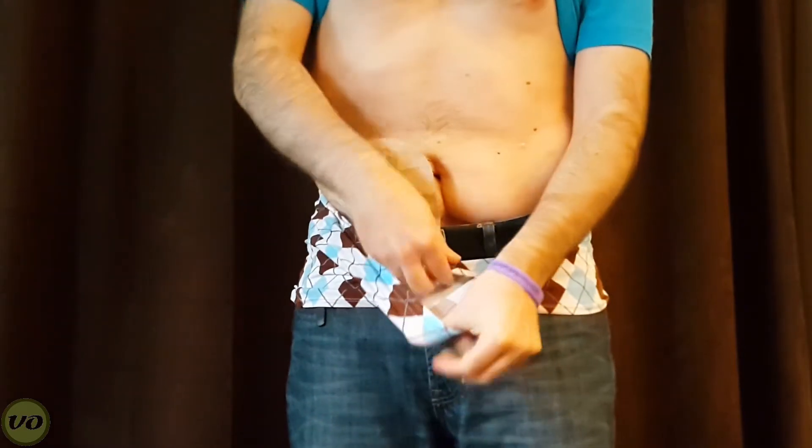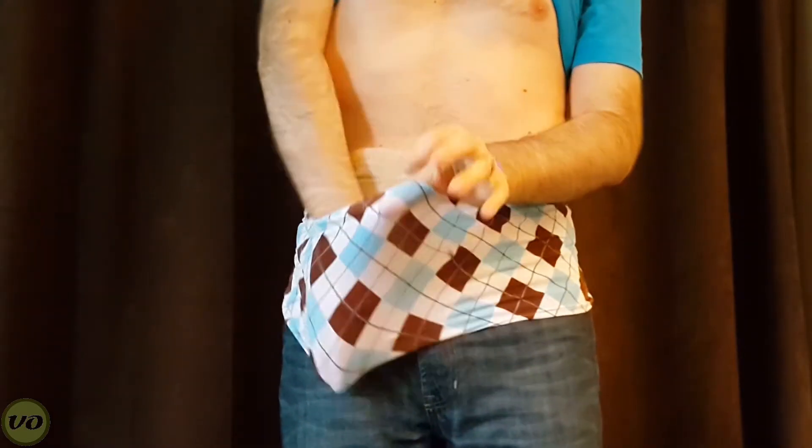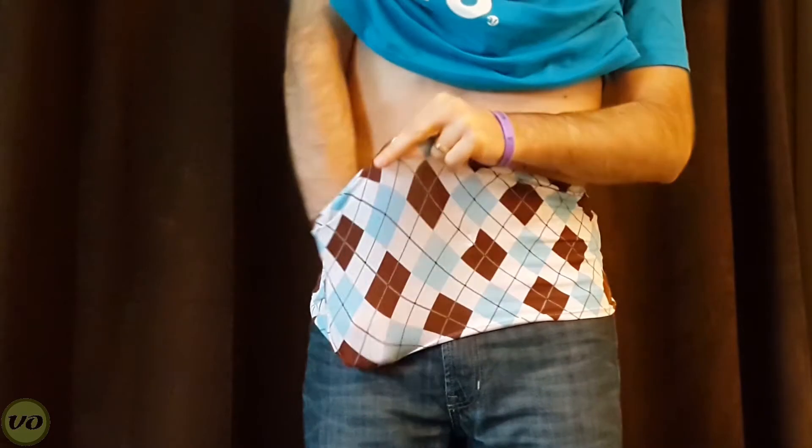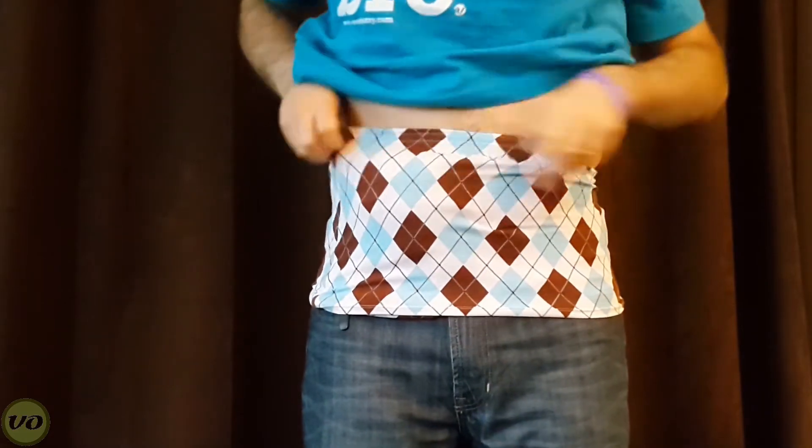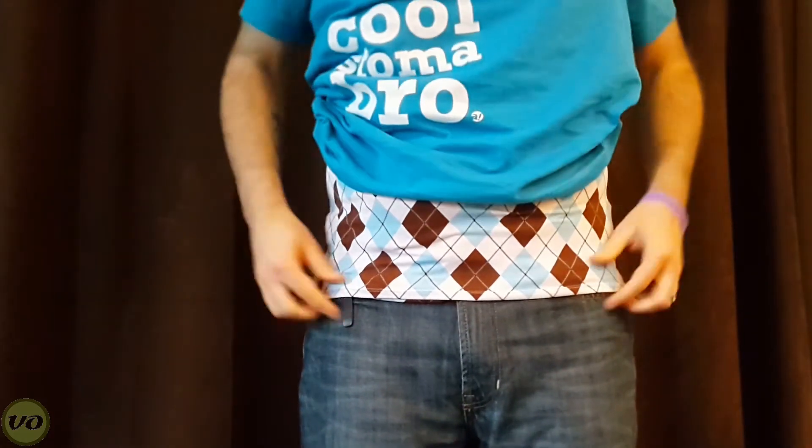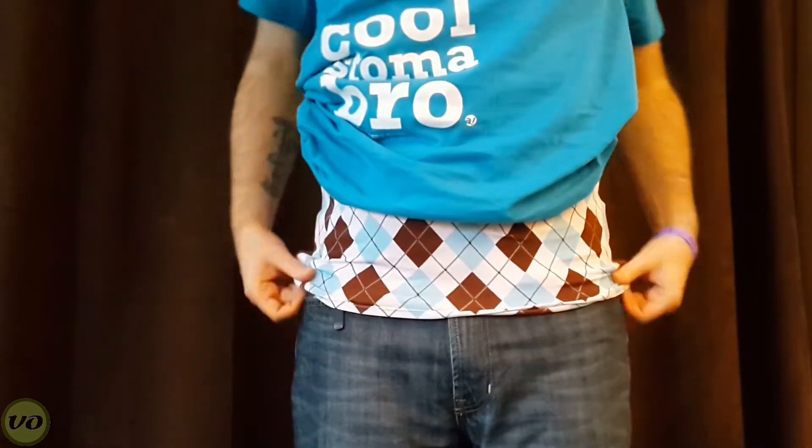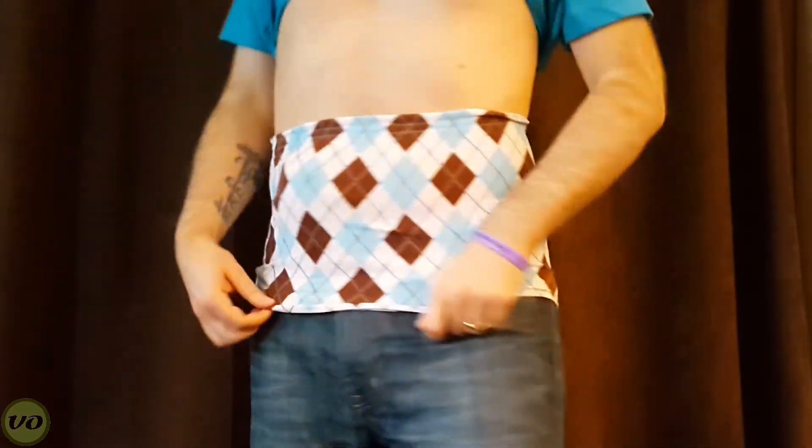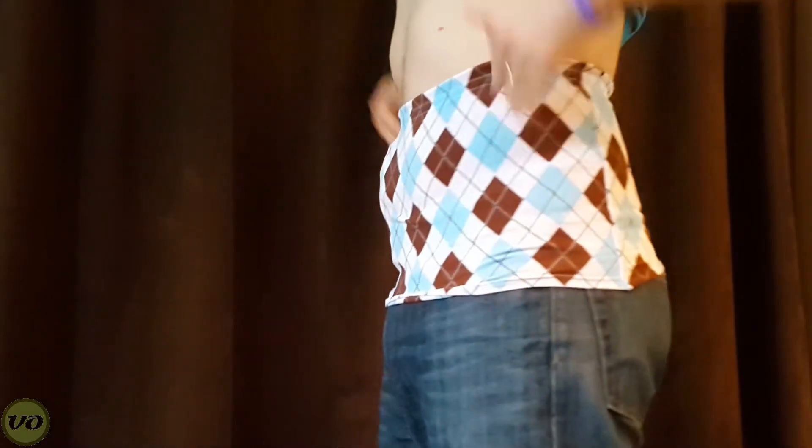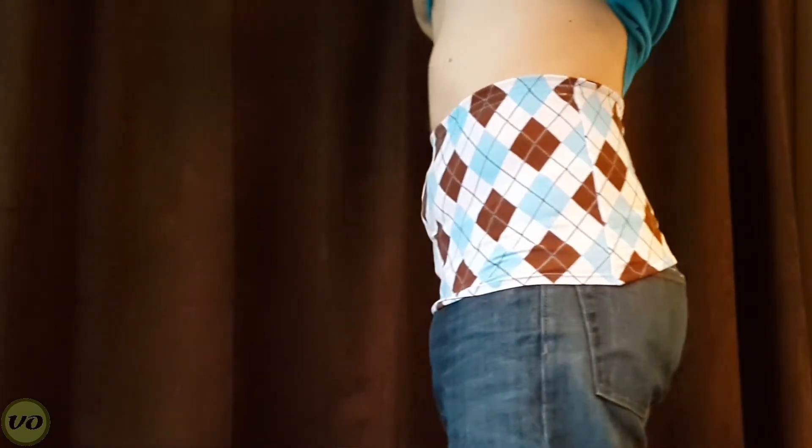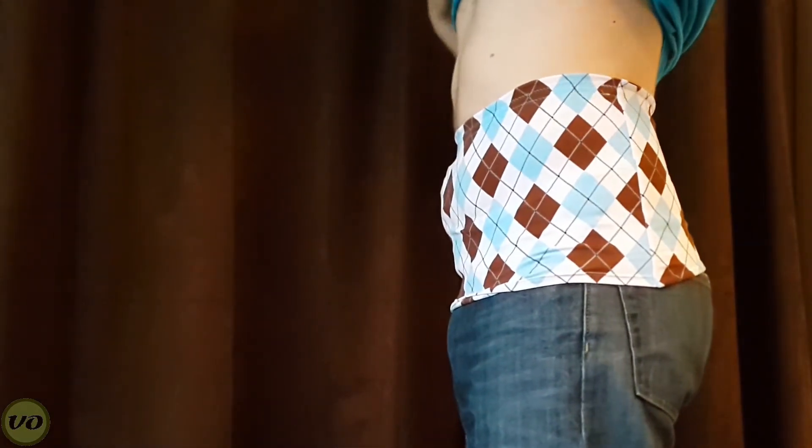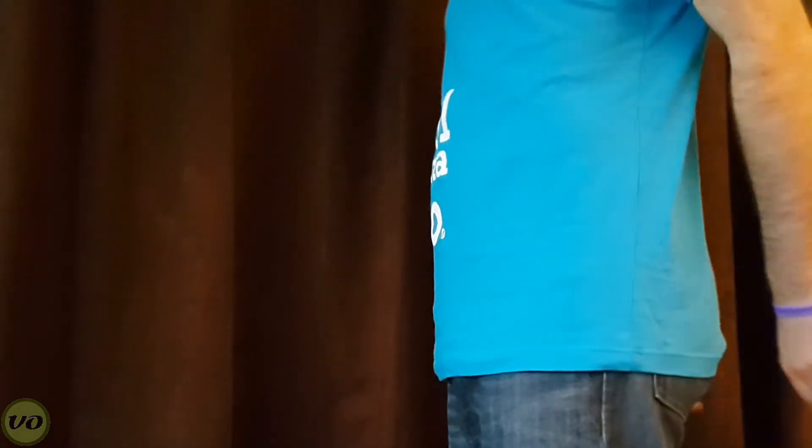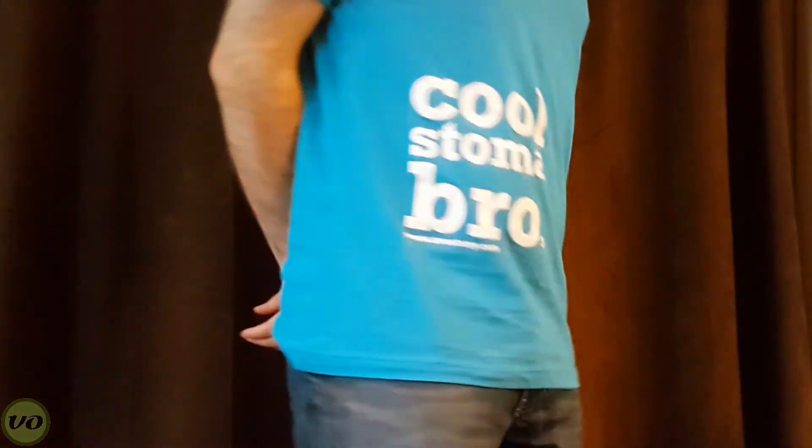Okay, so you can see here the pocket is exactly where I want it. All right, so you'll notice that it's a fairly low profile, especially once you have a shirt or something on. You can't really tell that you've got an ostomy there.